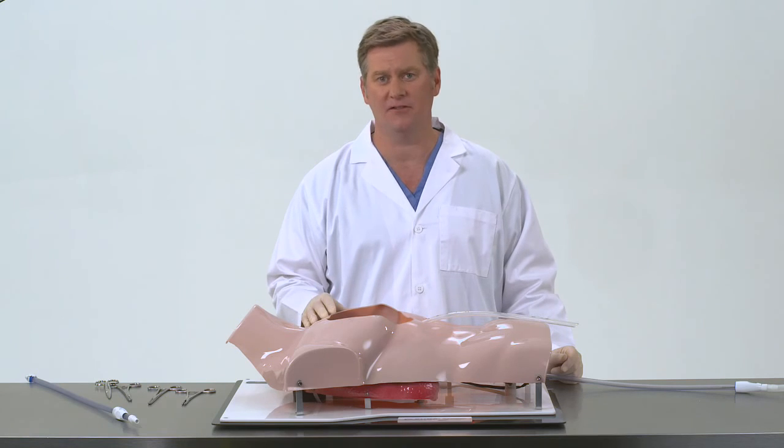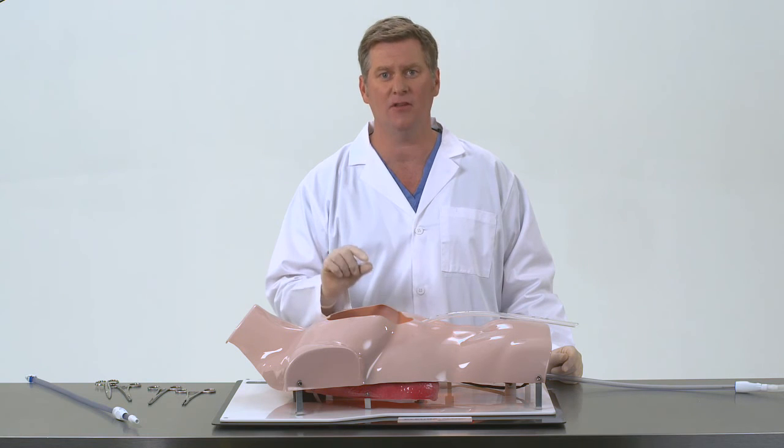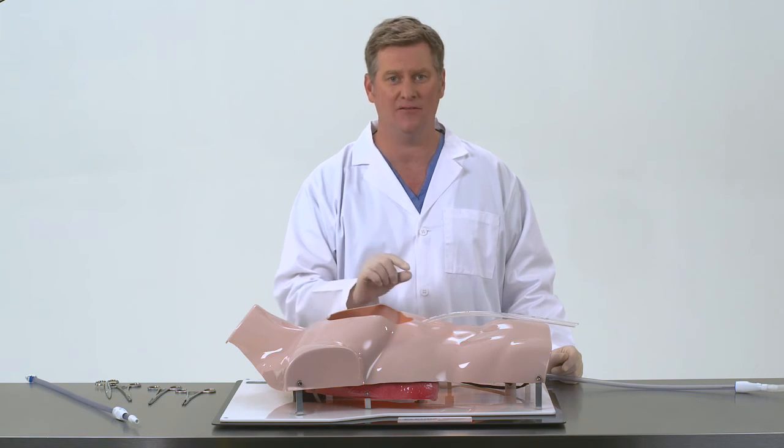All of these technical considerations have a similar theme. Take care to avoid any kinks, bends, or tube dimples that can obstruct the travel of the clearance loop in and out of the chest tube.